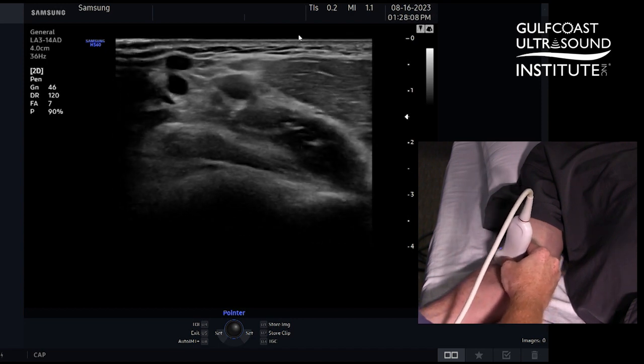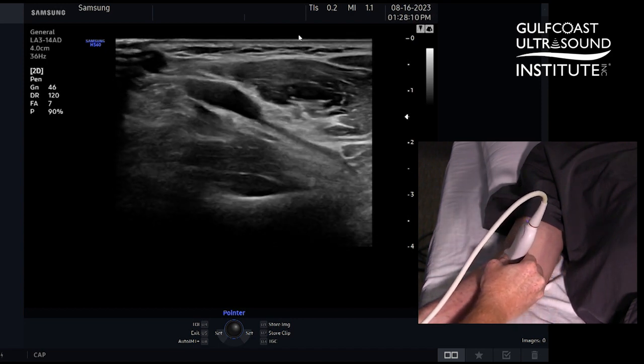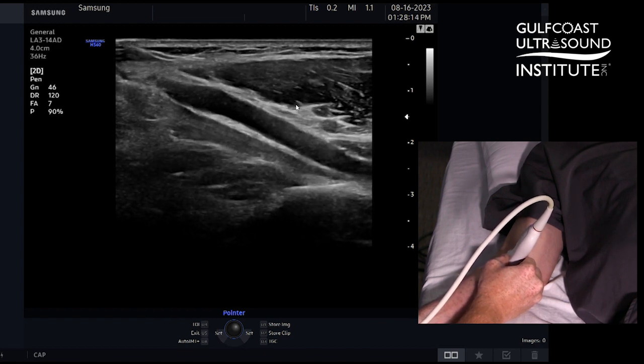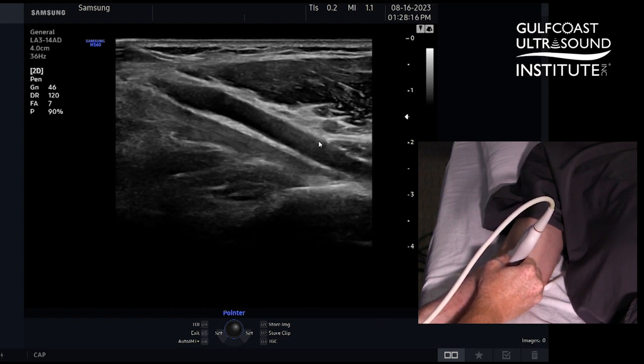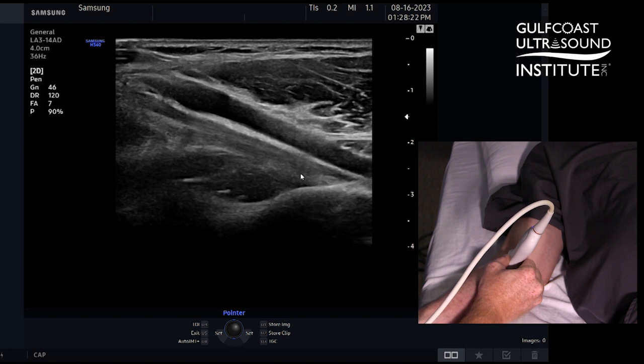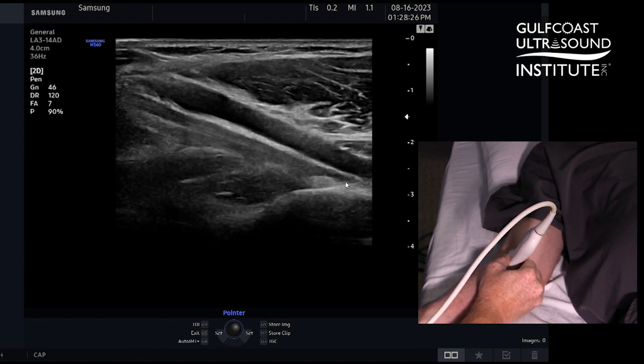kind of keeping everything in the center. I'm going to angle down this way, and here we can see — using the brachial artery in long before it branches — I'm able to see through that, use it as a window, and get a really nice view of the biceps tendon attaching onto the radius.